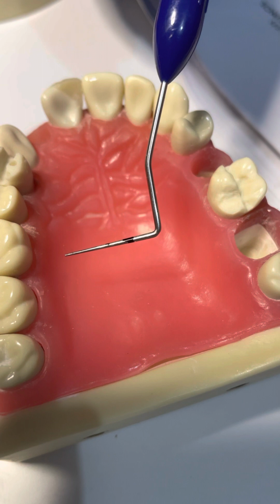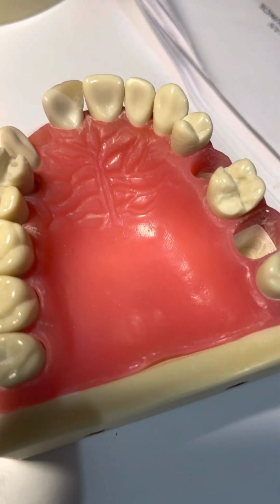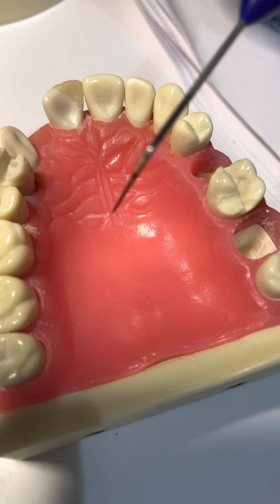The other thing I thought is that I'll take the teeth front and back out, then it's easy. The way that you did is easy also because you can see the anatomy and you are not nicking the adjacent tooth. I wasn't sure which burs to use, so I used the Fisher bur, but it was the angulated one. What do we call that one? The chamfer bur. Chamfer bur, yeah, I think so.